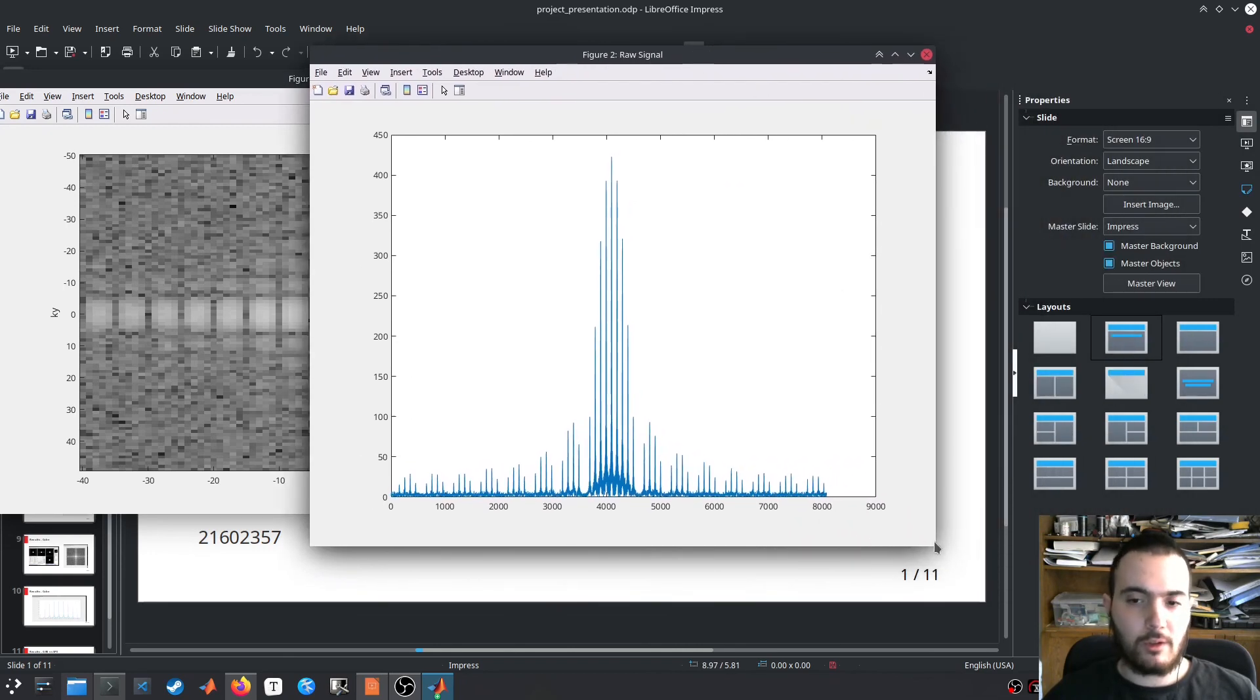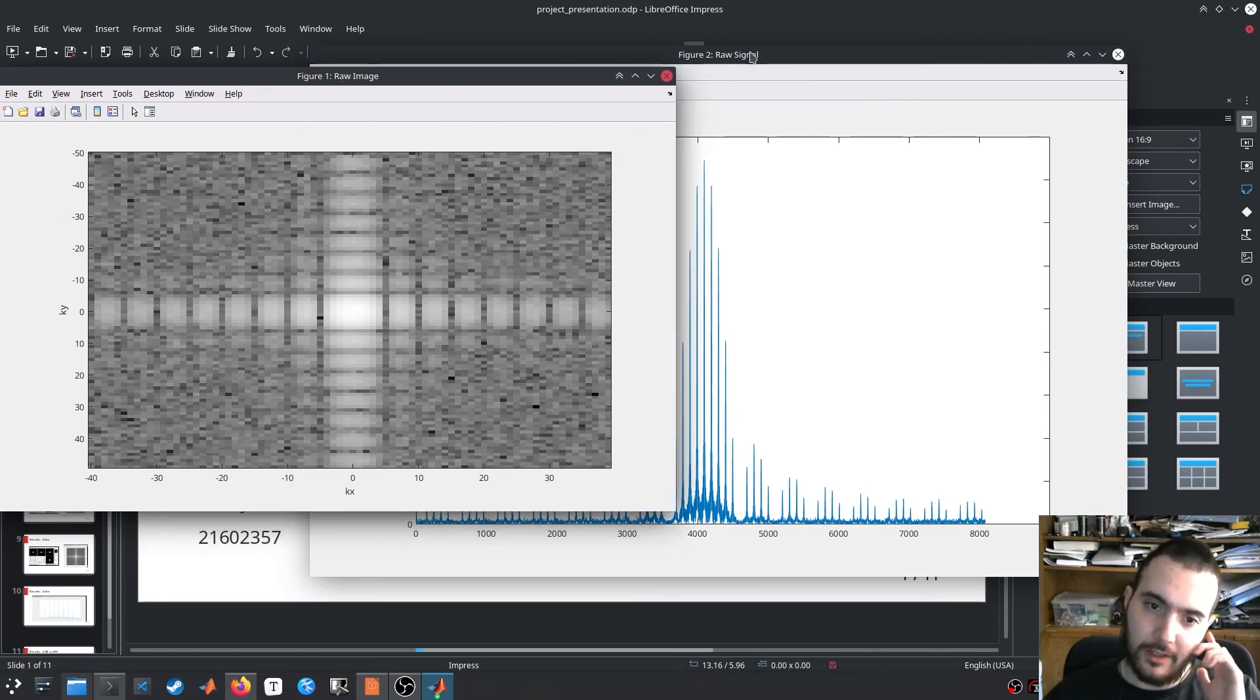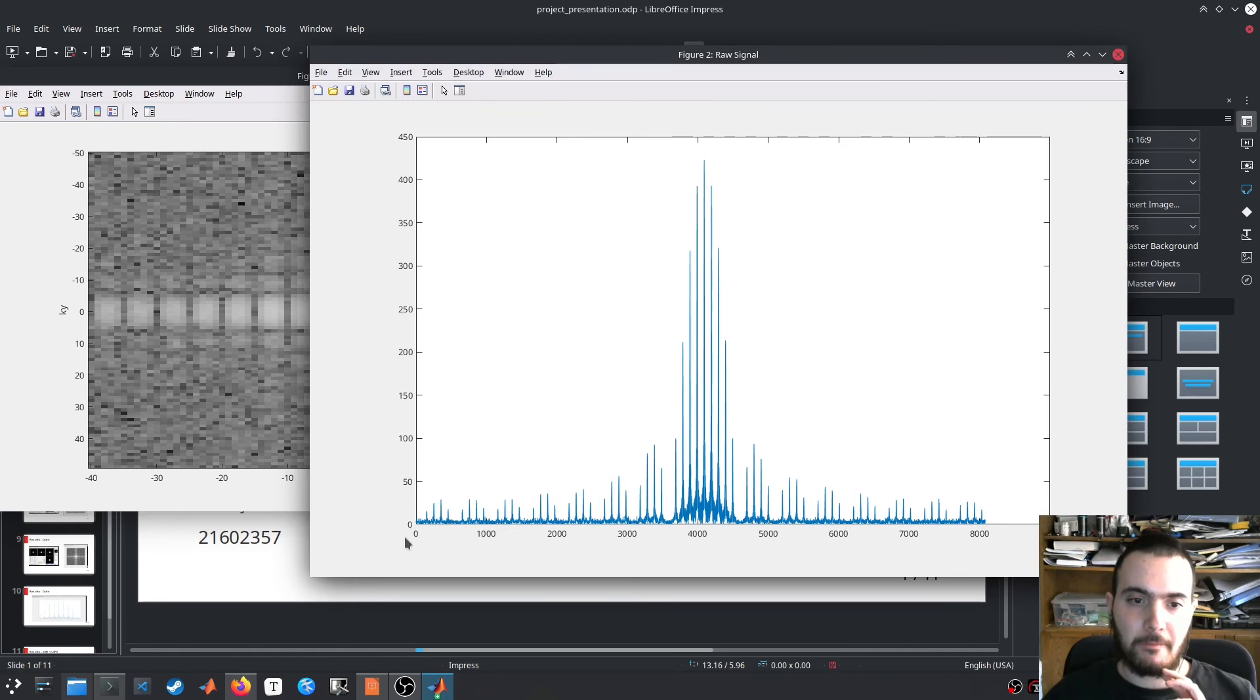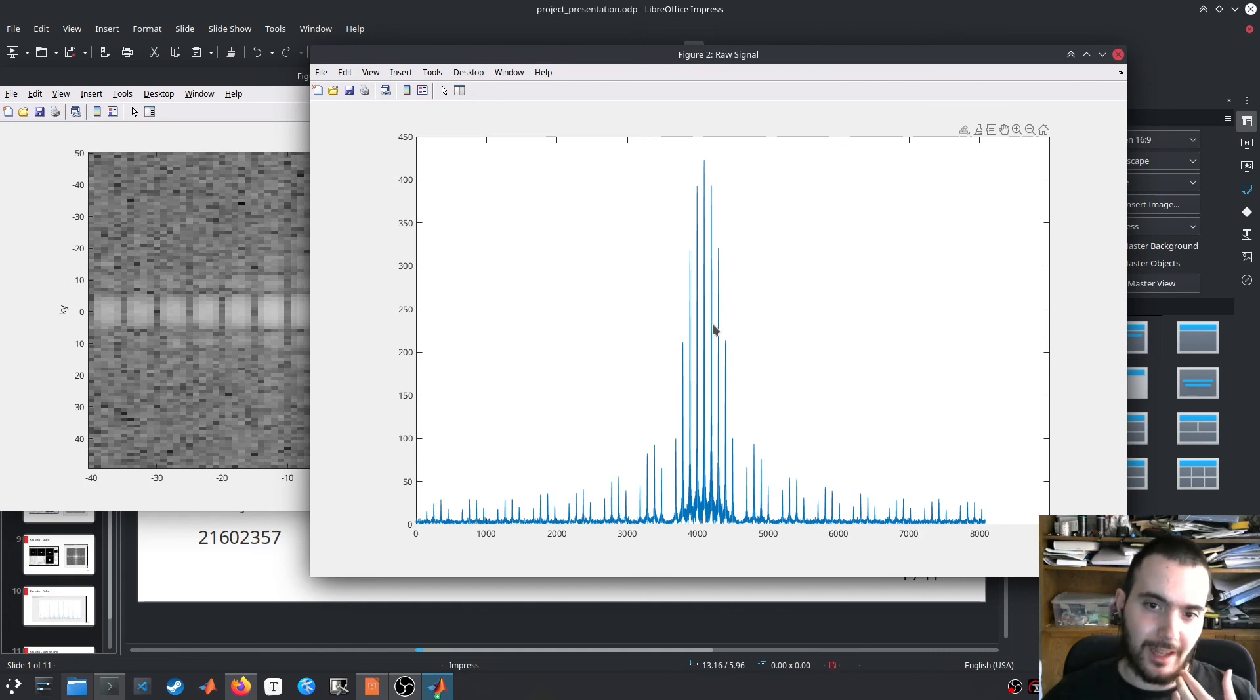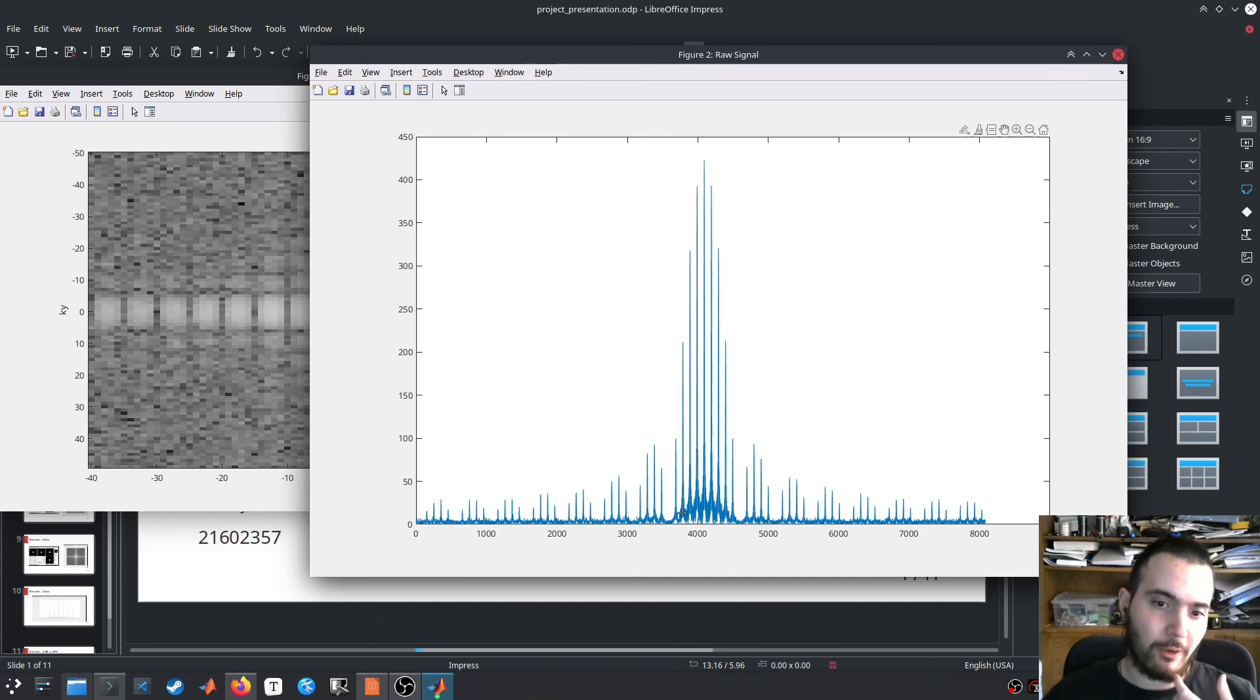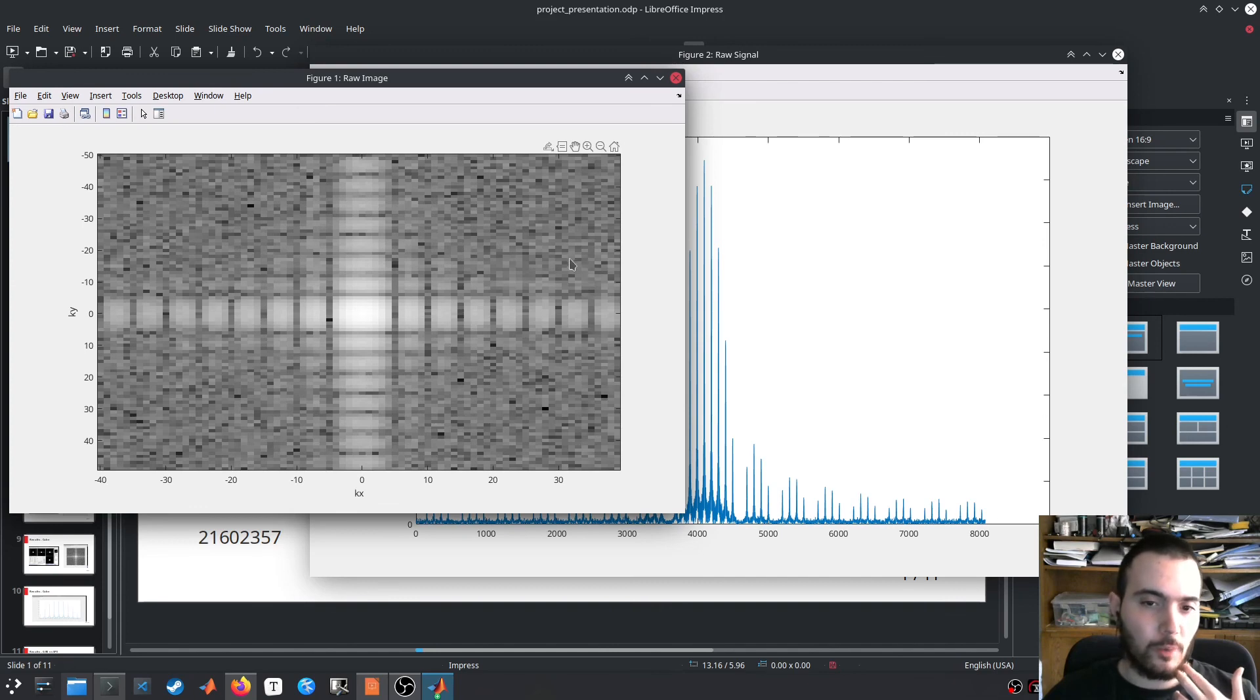In conclusion, I have added functionalities to see the raw image and the raw signal in MR lab. One downside is that these axes, for example in the raw signal view, we don't have the time series signal. So this says 4000, but it's actually the 4000th element. It would be nicer to know in milliseconds or microseconds which this 4000 corresponds to. To do that, I had to take the original time series array in the code, but I couldn't find it.